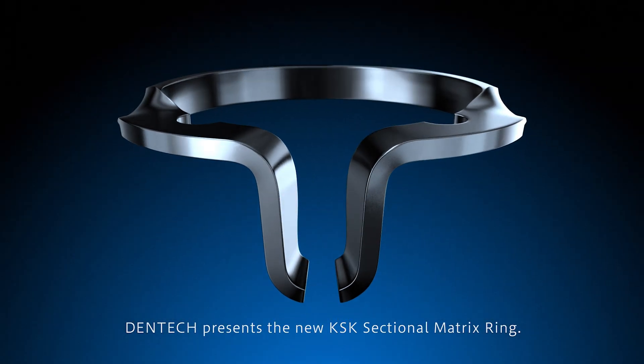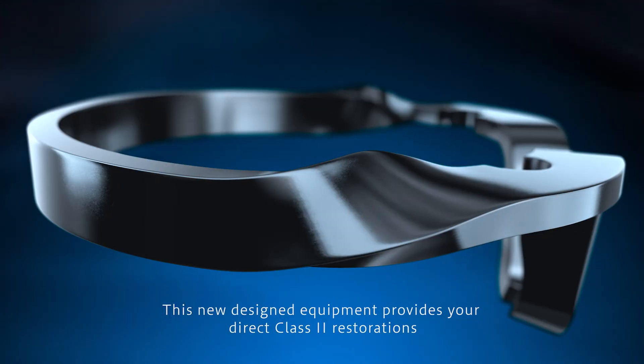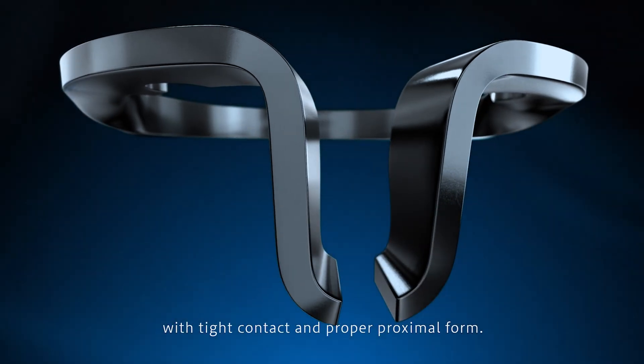Dentec presents the new KSK sectional matrix ring. This newly designed equipment provides your direct class 2 restorations with tight contact and proper proximal form.